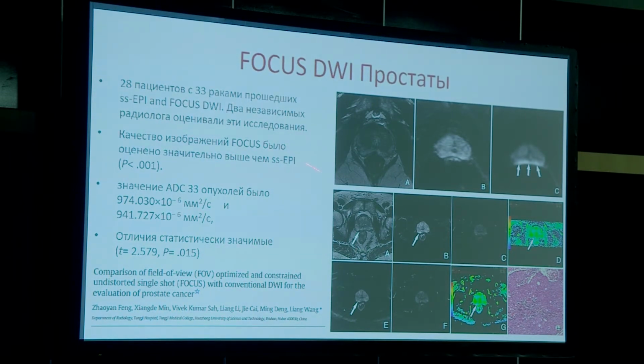I'd like to show you a publication which was done on 28 patients, where 33 cancers were found. Patients underwent single shot EPI and focus diffusion, and again here you can compare the image quality. This is standard single shot EPI, that is focus diffusion, and the susceptibility artifacts you have in the single shot technique, you do not see them in focus diffusion.